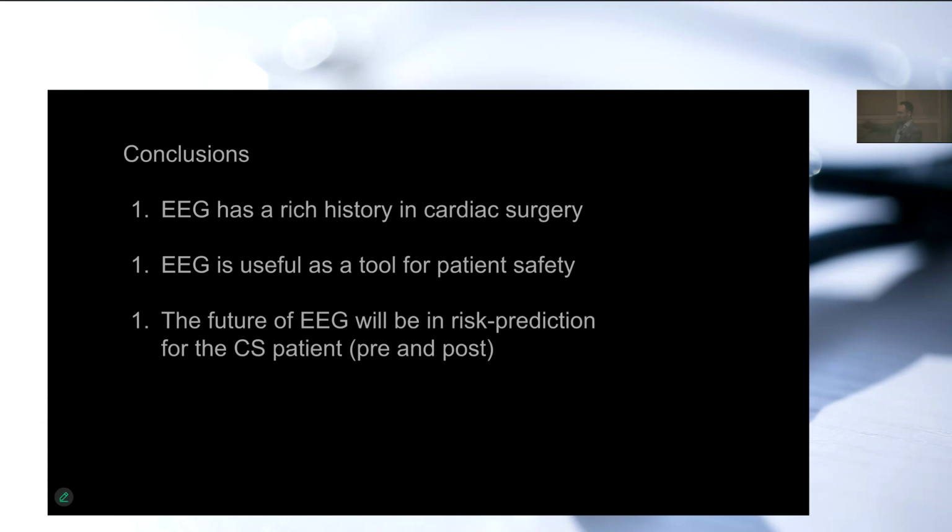You can't put an EEG machine in MRI for obvious reasons. We can, but not the ones we use anyway. They're ferromagnetic. But there was a group that did. They got a proper EEG machine that is MRI compatible, and they prospectively audited, blinded the anesthesiologist, just said, you do your normal thing. And we suppressed like 60% of these children and they all wake up fine and they go on to lead healthy lives, and there's no association of that with any ADHD or any neurocognitive outcomes at all.